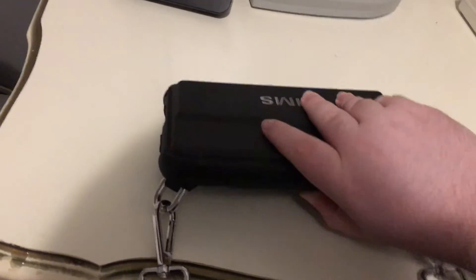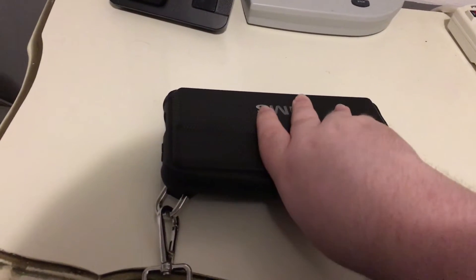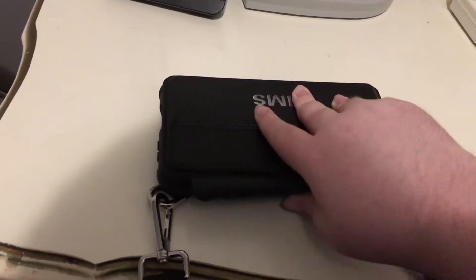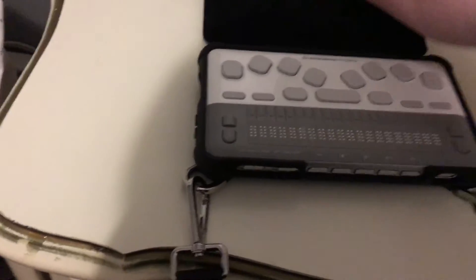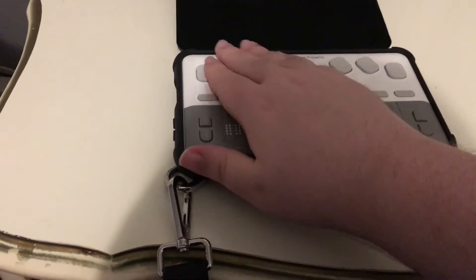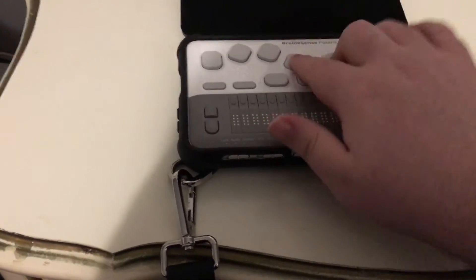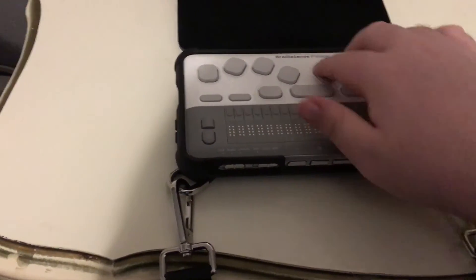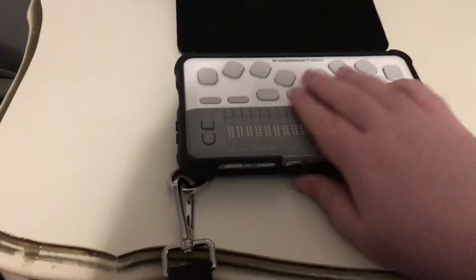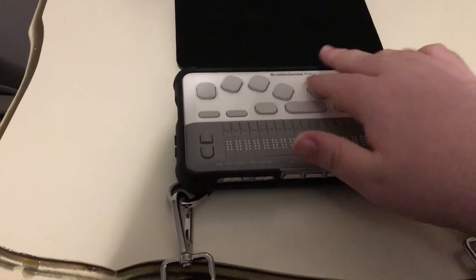So the front — it's currently closed, but with the case closed you'd have your Braille keyboard and Braille display. Let's open the case up. You have your Perkins-style Braille keyboard, and it's not a loud keyboard at all, which is really great. If you're typing in class or in a meeting, you really won't be distracting people.